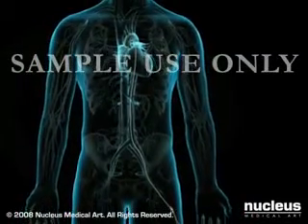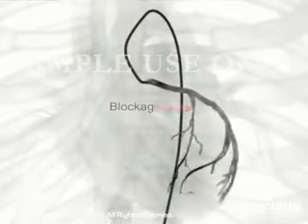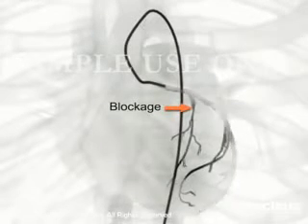To evaluate the coronary arteries, your doctor will remove the guide wire, position the tip of the catheter just inside the arteries, one at a time, and inject a special dye. This dye allows the fluoroscope to take X-ray images, called angiograms, of the artery's interior. Any blockages will be clearly identified as the arteries fill with dye. You may feel flushed or slightly nauseated when the dye is injected.